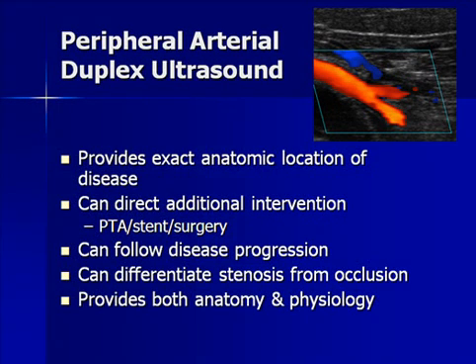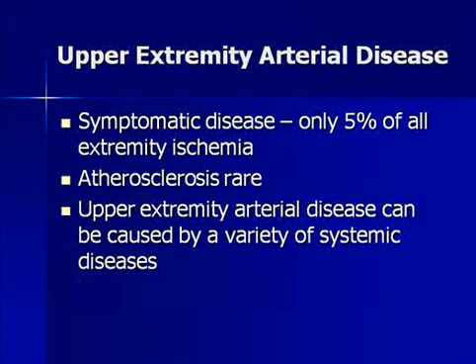And ultrasound is great because we can get that anatomy that I discussed, but we can also get the physiology. We can look at velocity waveforms and shapes, and we know what is going on both at that point and what is going on in the tissue bed being supplied by that vessel.